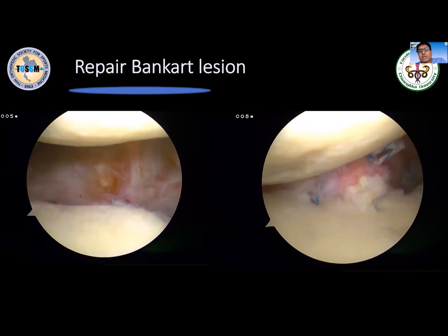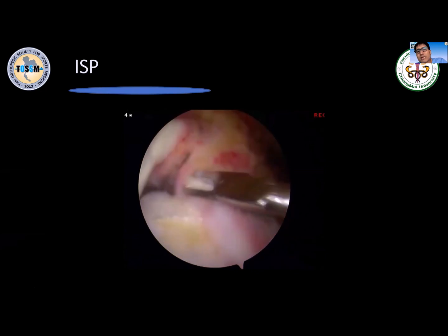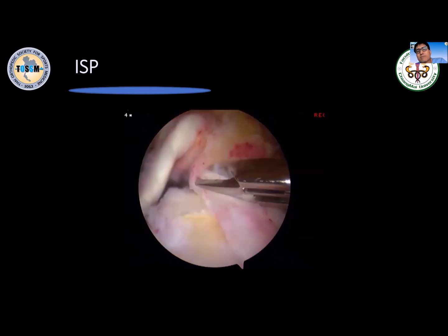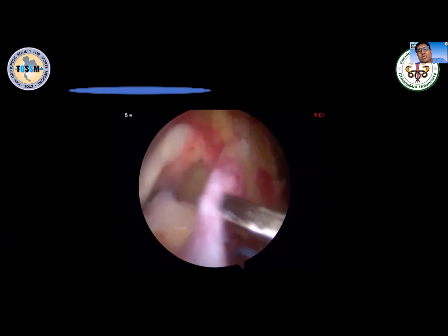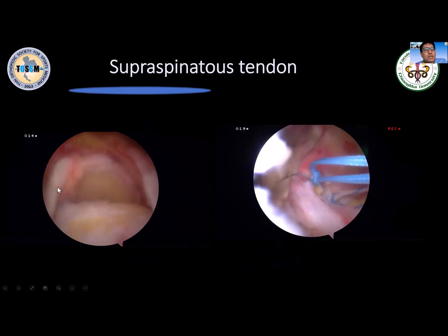So when I deal with this, I usually pad the labrum because we're not sure that we can reconstruct the subscapularis well. And then this is infraspinatus. See that you can bring it back to the front like that. Not too bad though. You can cover it with some part of the posterior part of the infraspinatus. So we stitch just like we did, with the suture anchor, getting it close to the bicep. And this is a picture before the surgery. And after repair, we repaired the infraspinatus, covered the humeral head, and we did the tenodesis of the anterior cable reconstruction of the biceps and tied them together.